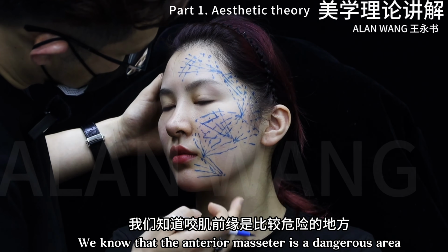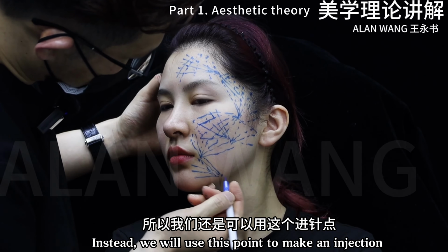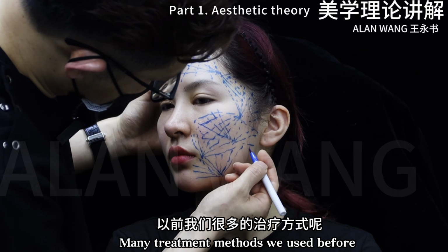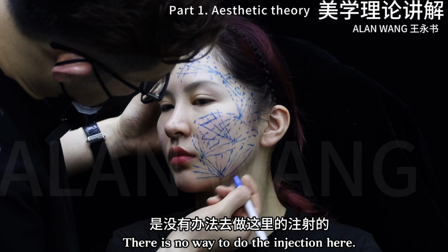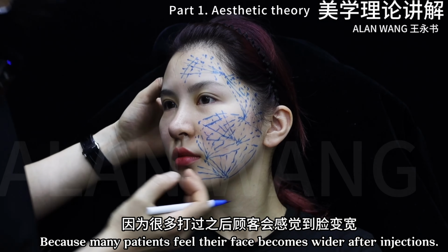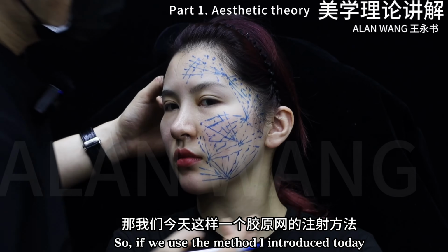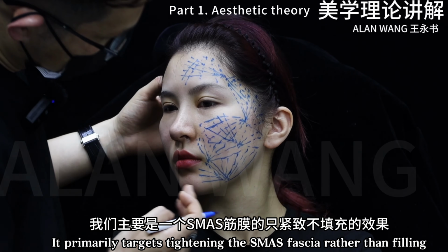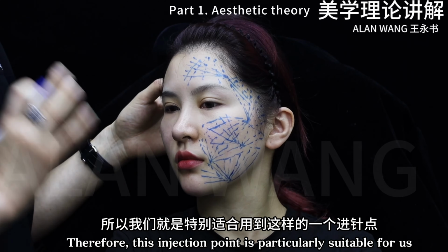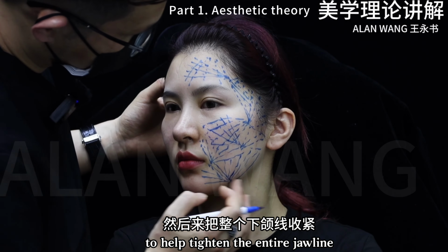We know that the anterior masseter is a dangerous area. Instead, we will use this point to make an injection that could help in tightening the entire jawline. With many treatment methods we used before, there was no way to do the injection here because many patients felt their face became wider after injections, some sort of problems. So if we use the method I introduced today, it primarily targets tightening the superficial fascia rather than filling. Therefore, this injection point is particularly suitable for helping tighten the entire jawline.